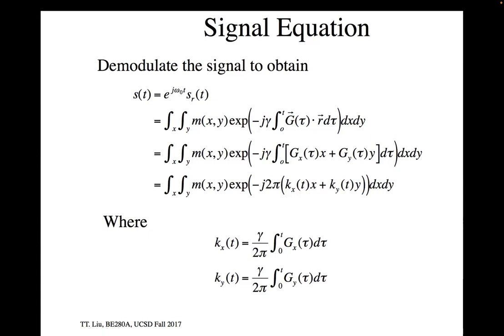And so from 0 to time t, we have a gradient on, you multiply by whatever your x position is for the magnetization, the y gradient multiplied by its y position, and you integrate that, right? And that will give you essentially, because this is a frequency shift, right? When you integrate it, it gives you a net phase shift for the magnetization at x and y, okay?